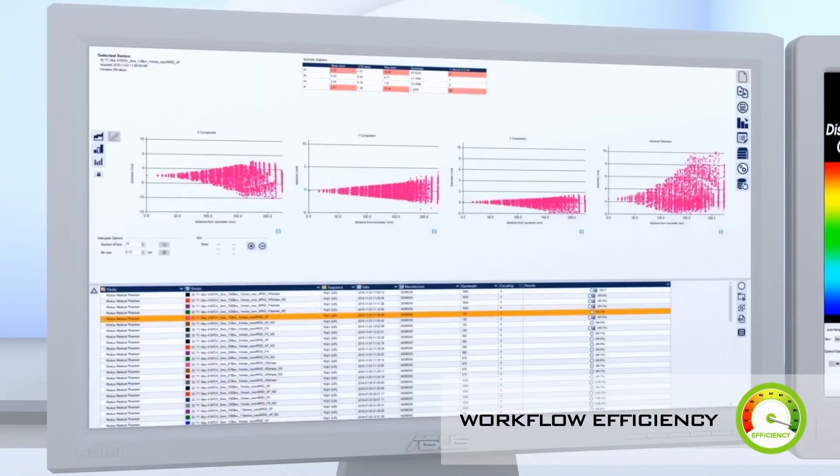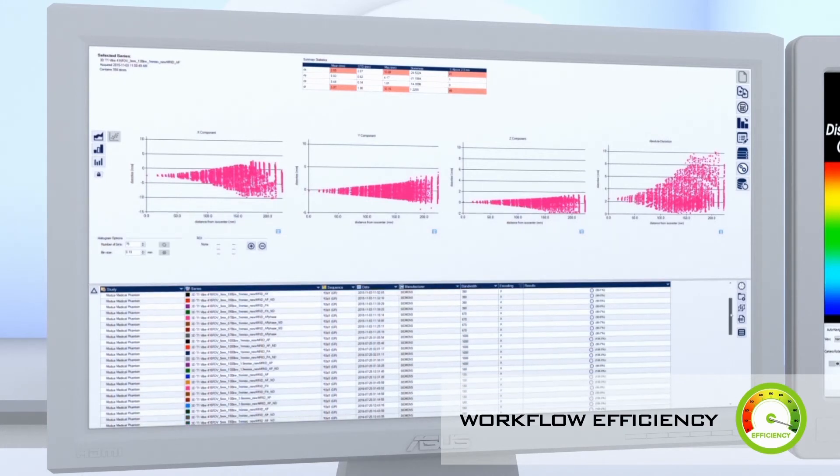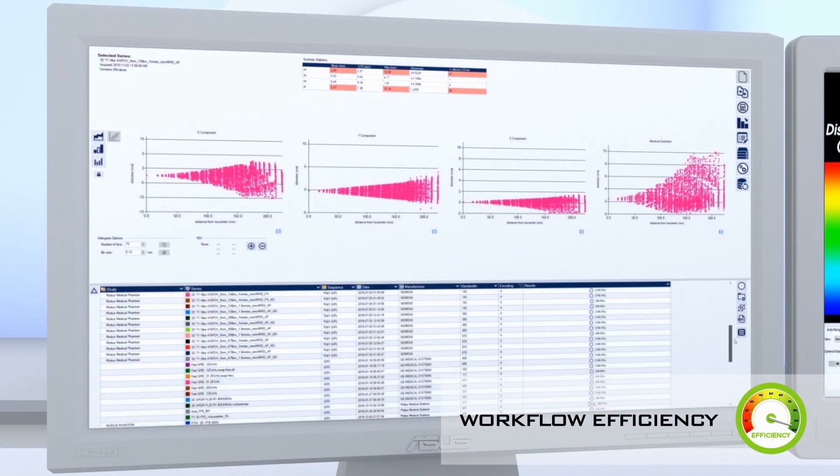To improve workflow efficiency, automated processes are used to identify location of control points, quantify geometric distortions, calculate distortion vector fields, and produce statistical analysis.